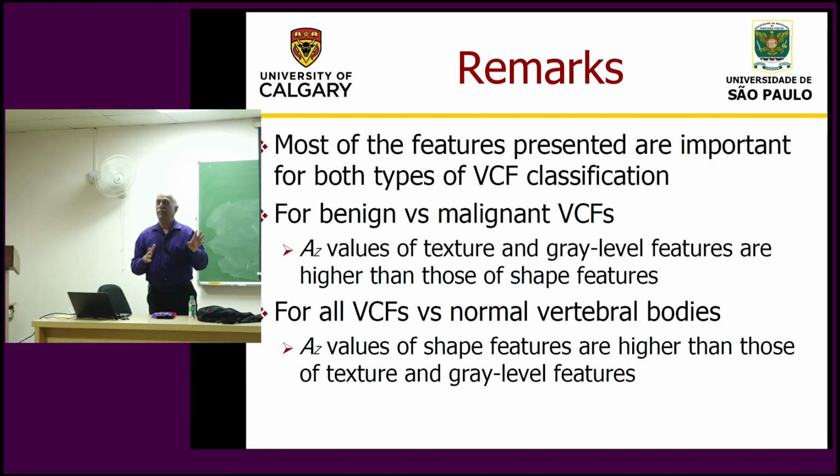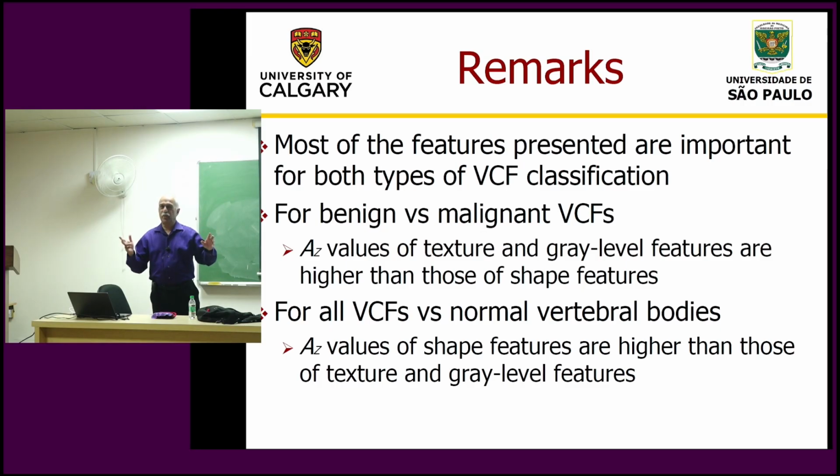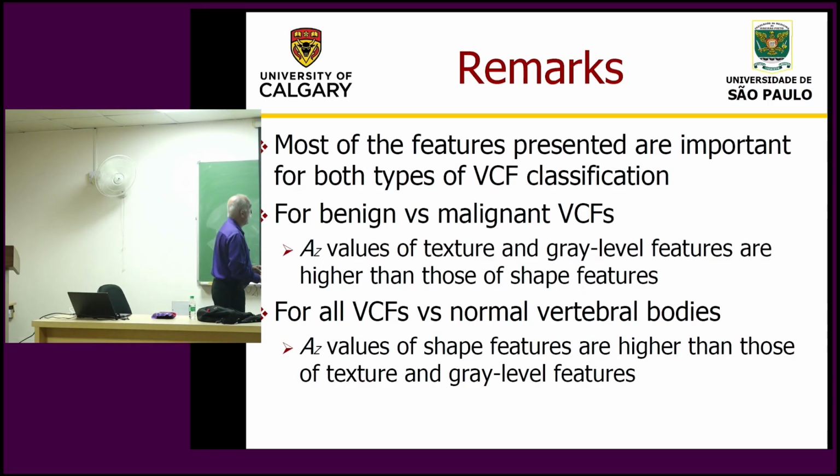It's not unrelated to the classifier. So that may be a good strategy in feature selection. And then you can say, okay, I want to use this pattern classification method. How many features are being selected through the wrapper-based method? And if it selects too many, you can say, well, I don't want that many features, try something else.